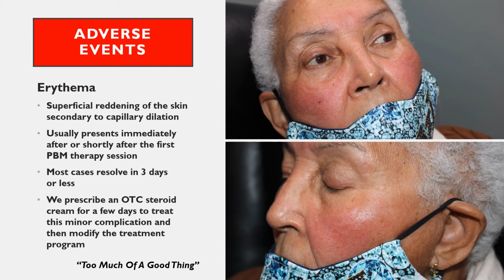I'd say this is an example of the worst skin reddening. This is the worst. I took a picture of it. It was that bad. This is the worst patient I've had in 7 months as far as erythema after a treatment. And this is her right after we took the mask off. You see all the redness right here, the erythema. That was not there before we applied the mask. And she felt it. I said, "Do you feel okay?" She said, "Nah, it's a little tingly here. It's a little funky." I'm like, "Okay, fine."